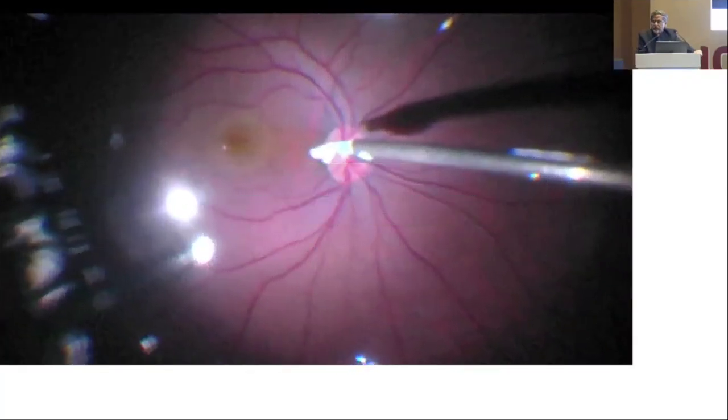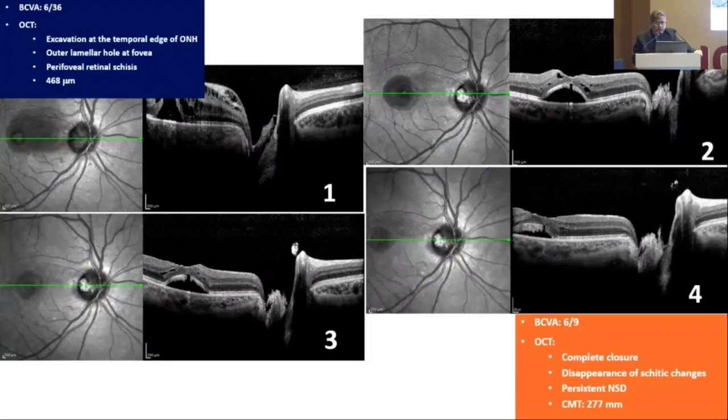Next presentation. So this is a case, as you can see above. This patient is an IB officer with vision of 6/36. I think he came initially. So we have put the plug. As you can see, this is a scleral plug, and you can see here also.